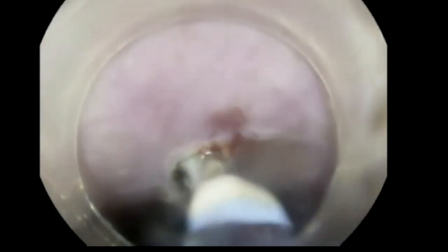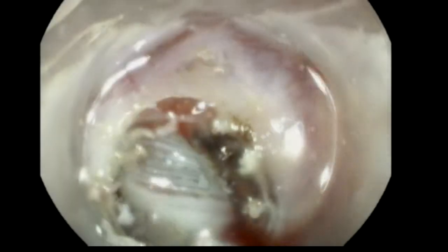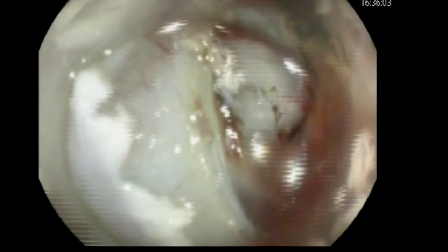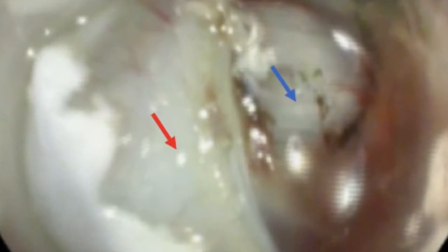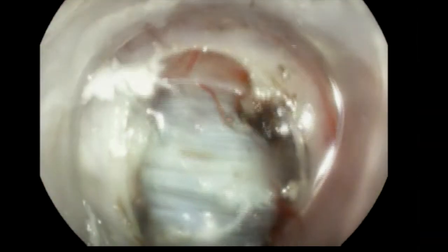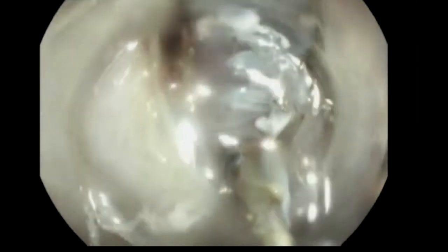In spite of doing the initial incision, we have some bleeding. We're using a coag current to cauterize it. But as we can see here, just from the first part, we're really getting too deep. You can see the muscle layer and the muscularis mucosa. The muscularis propria is indicated by the blue arrow and the muscularis mucosa by the red arrow.